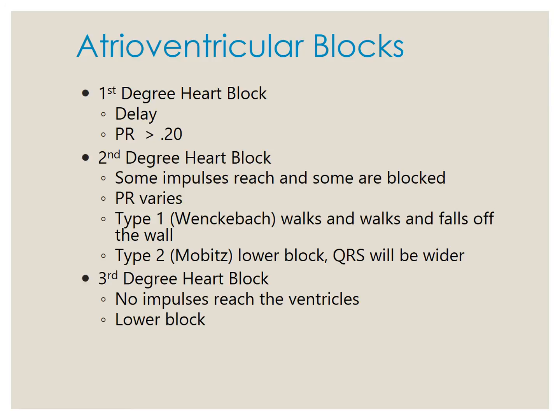Okay, atrioventricular blocks. We're going to go through these, and I'm going to explain the second degree also, but you do not need to know second degree for the exam. They are going to be going more in detail with that next semester. But the first degree AV block is the one that I'm going to be talking about.